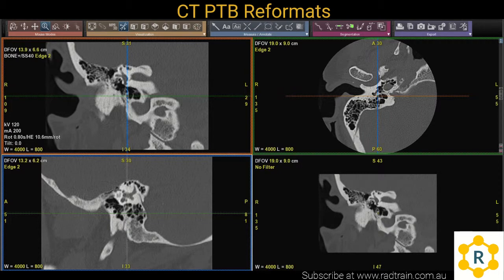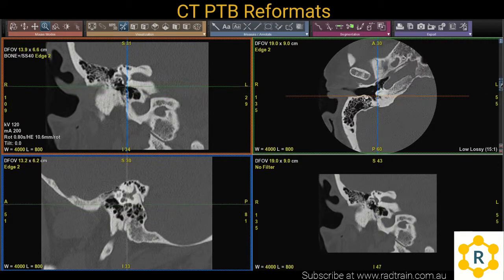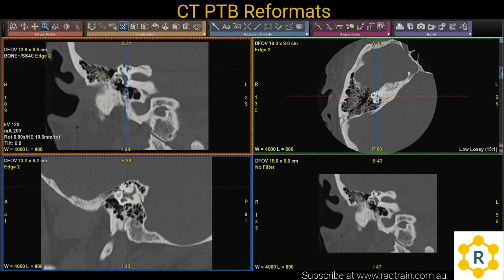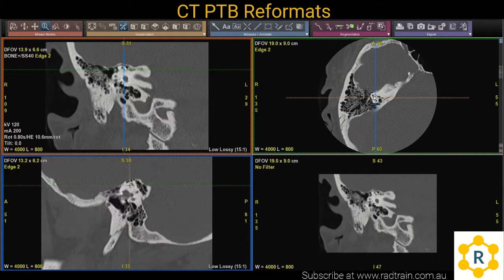When I first started out doing CTs, I always found PTB reformats a bit of a challenge. So I wanted to give you a few tips today on how to get the best reformats.